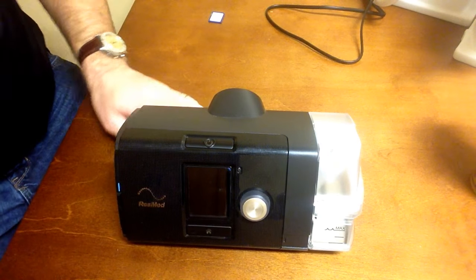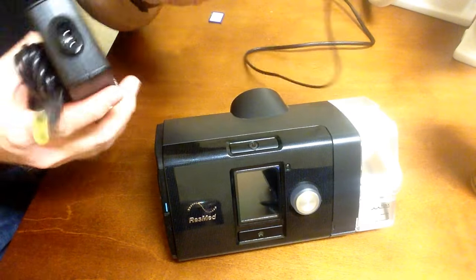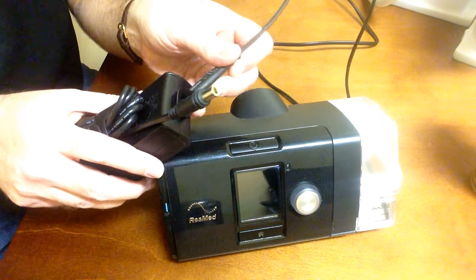The power attachment on the AirSense 10 and AirCurve is on the rear side of the machine — it's simply the round port where your cord plugs in, and your wall cord plugs into the other side of that power adapter.